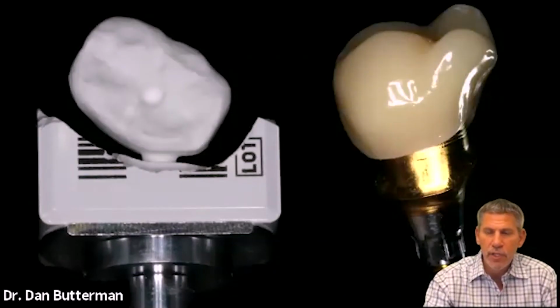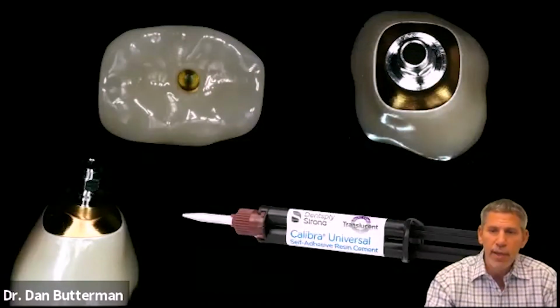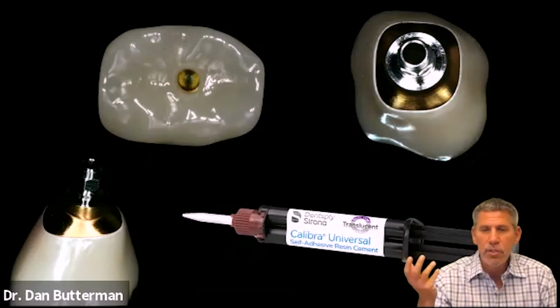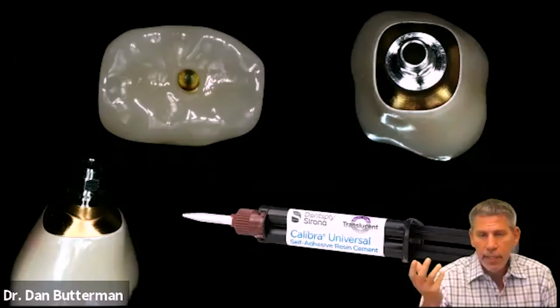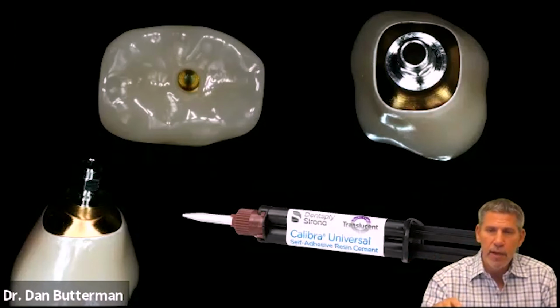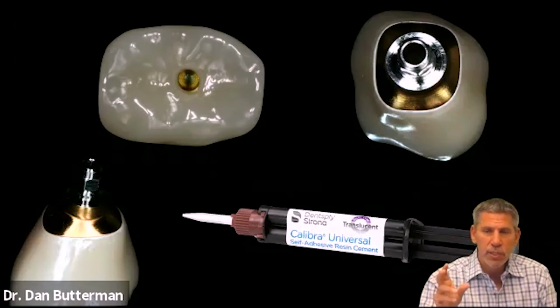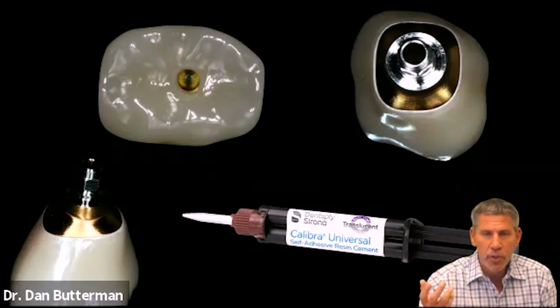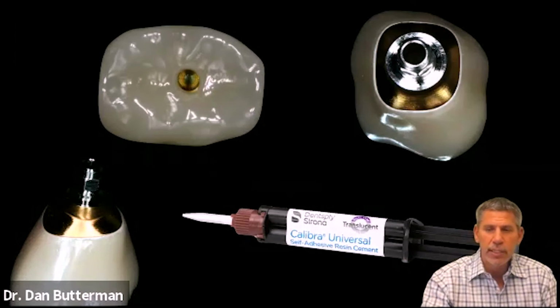So here's my milled restoration and the abutment that came back from Atlantis. Again, the lab would just be doing that for you. And then we just put these two pieces together. Basically what I'm going to do is take my crown and put it onto my abutment extraorally, and then I'll just screw that into the mouth. So we're cementing these two pieces extraorally, and then this is just going to torque into the mouth as one complex.